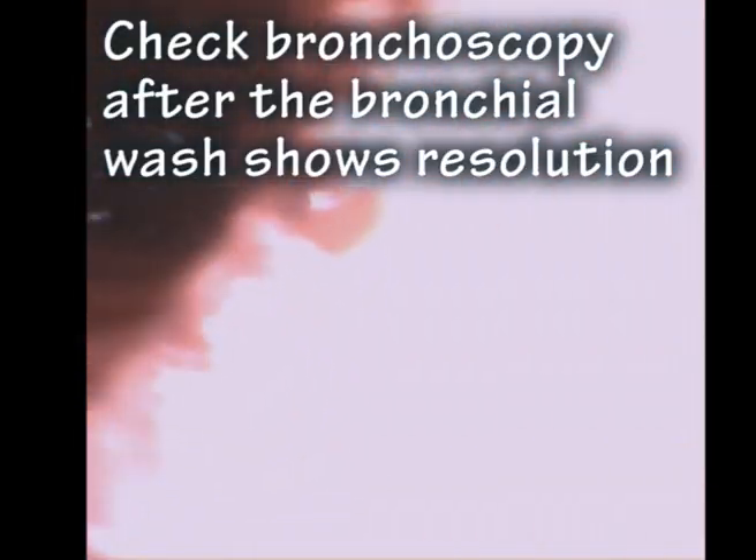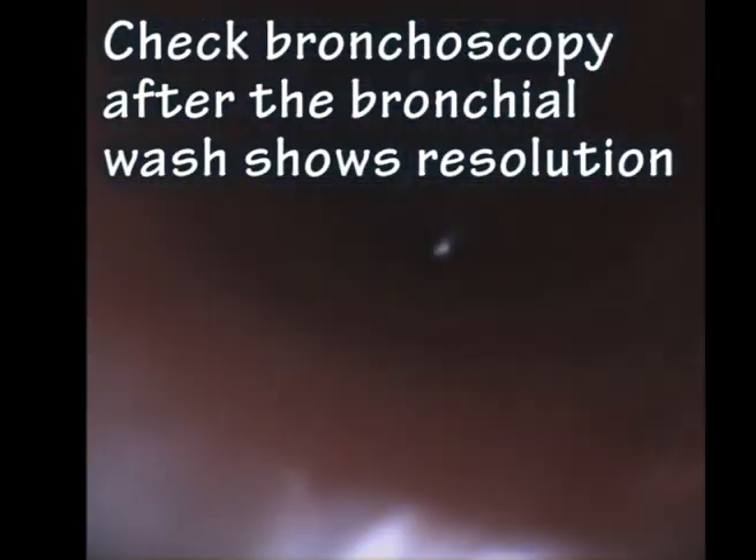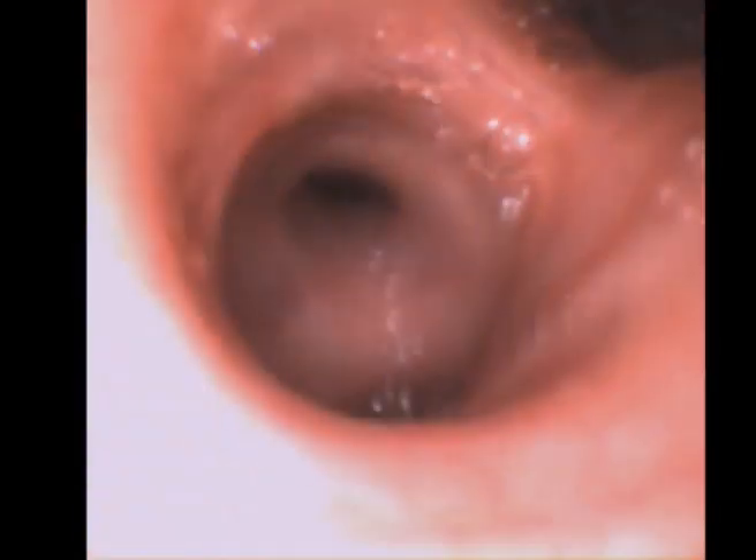These are the typical appearances of a bronchoscopy following a bronchial wash or bronchial lavage. Here, the endoscope is advanced to the right lower lobe again. Only this time, once the small bubbles have been cleared, you can see that the right lower lobe orifice is now pretty clear.